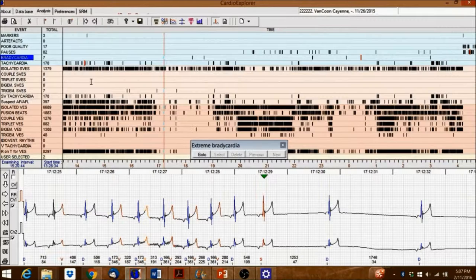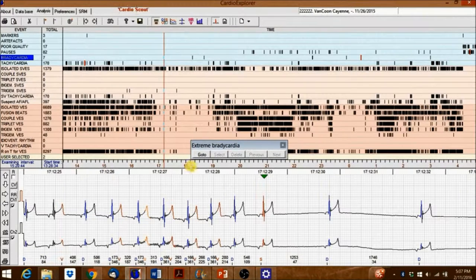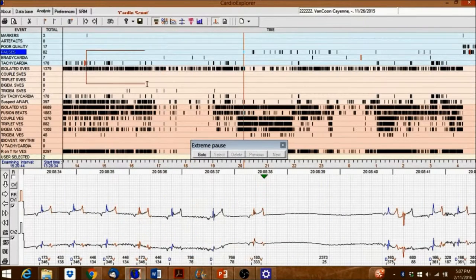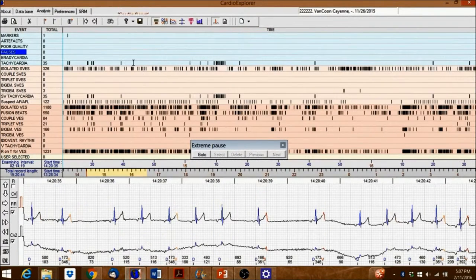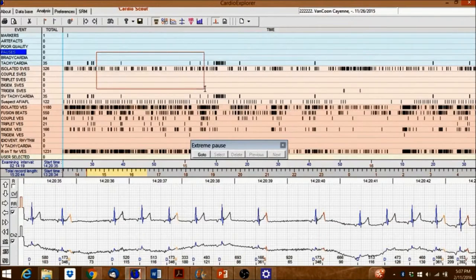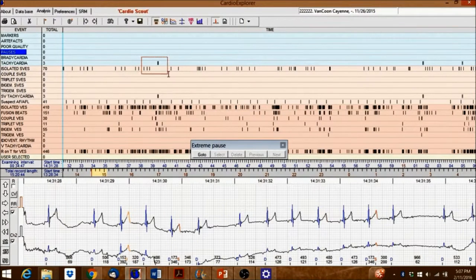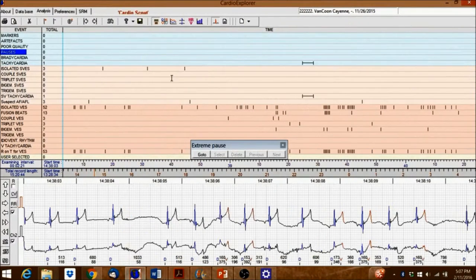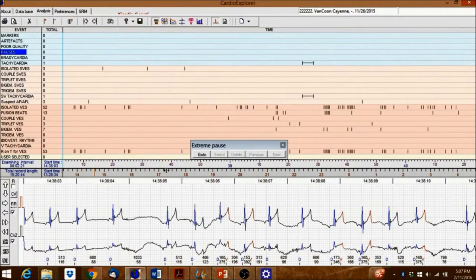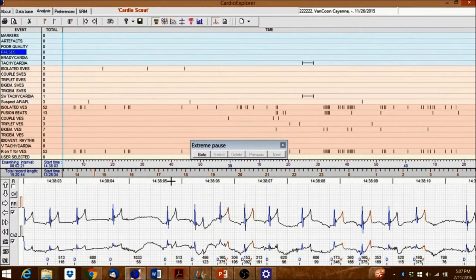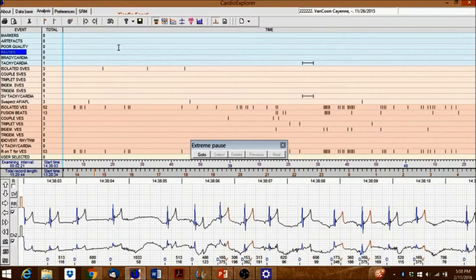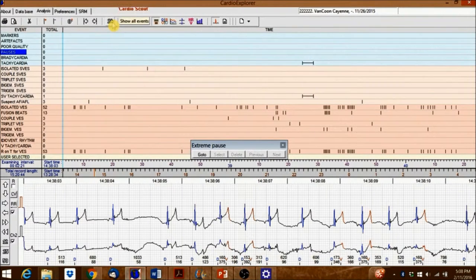Right-click, hold and drag to zoom in closer to the events. Notice that this creates a secondary horizontal time bar and a more detailed overview of the events captured. Clicking on the 24 button at the top will return to the default view.